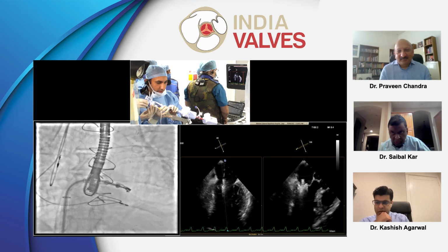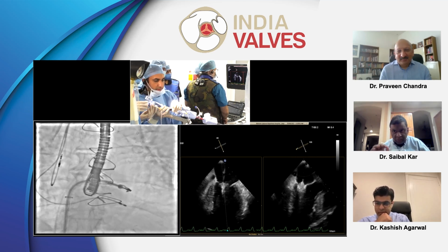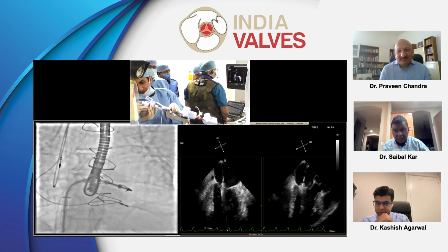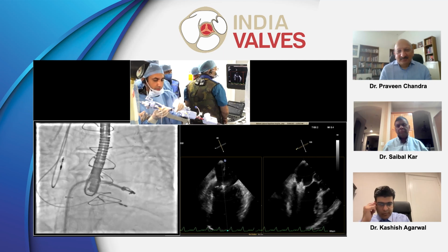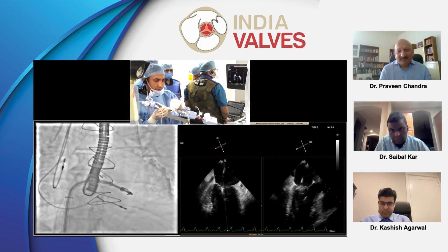Now you have that posterior. Now you've got posterior in. Okay. Wait. Advance the clip a little so it doesn't slip out. Wait a minute, close the clip. Okay, close the clip. And what happened to LA pressure? I'll show you. Wait a minute. I just advance the clip a little forward just to get rid of the tension. And we're going to close it.